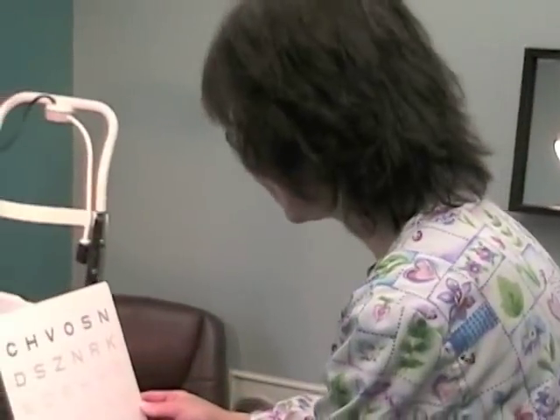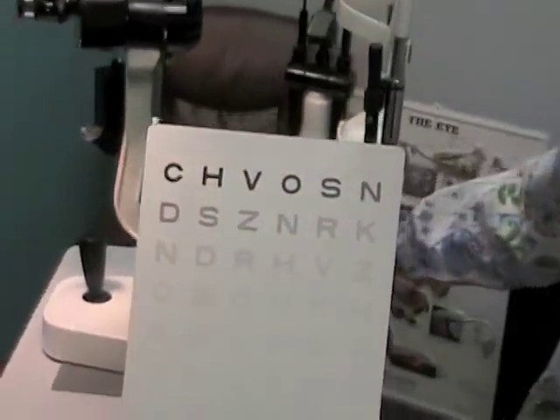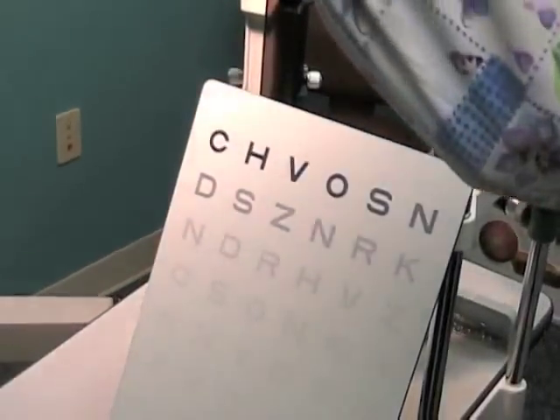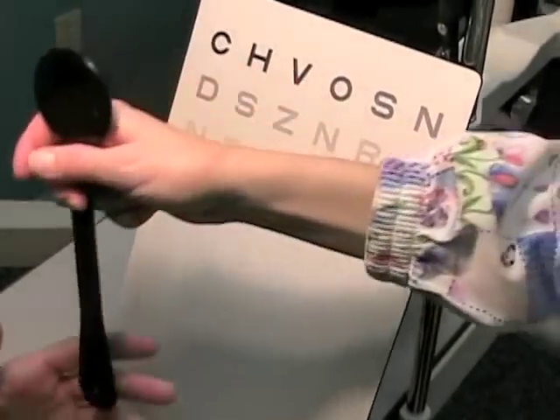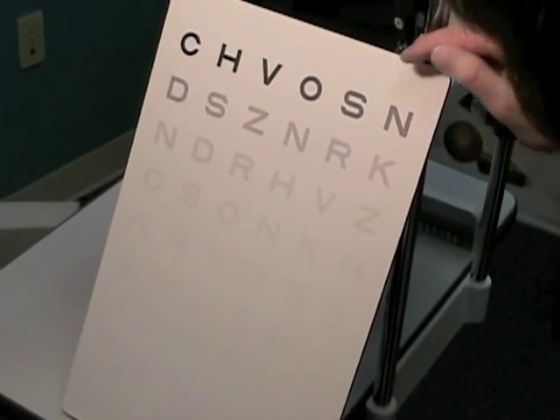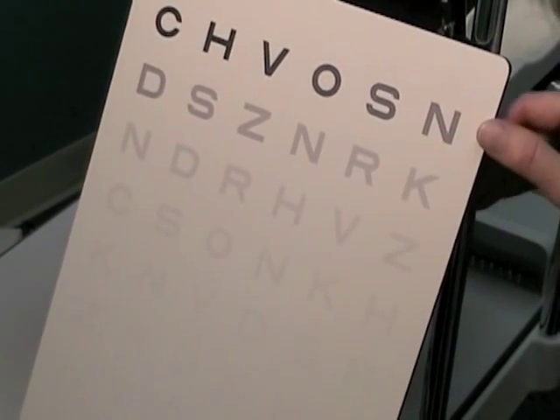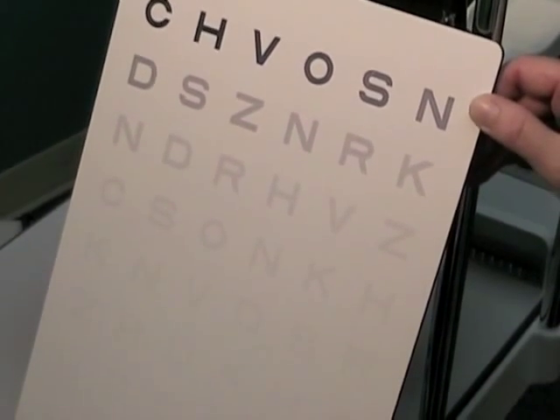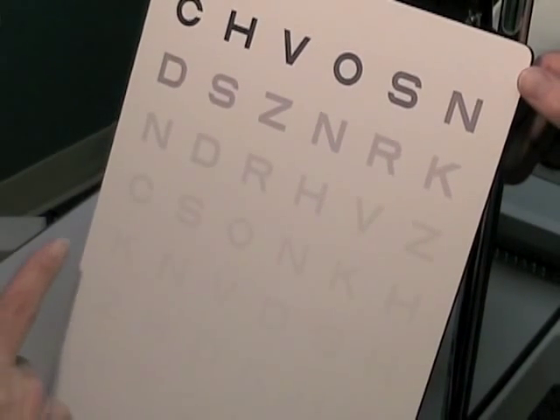Mr. Rothenberg, what we're going to be doing next is testing your contrast sensitivity. If you could cover your left eye — as you see on this chart, the letters are very dark on the top and they gradually become much more faint. What is the lowest line that you can see easily that you can read?